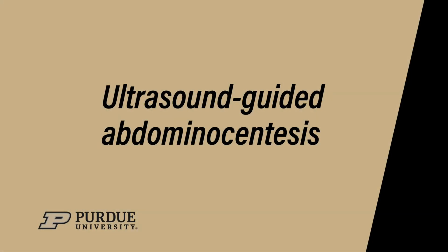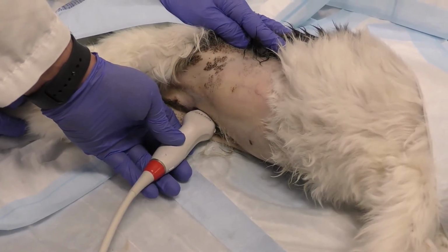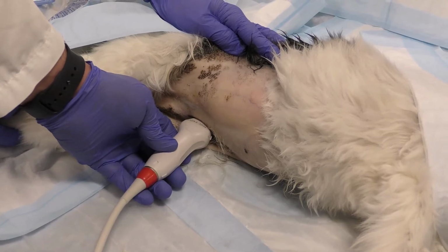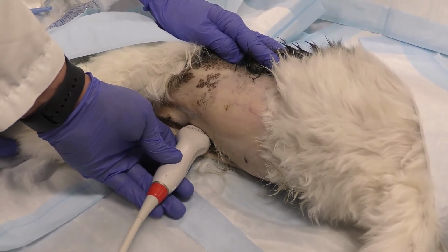Ultrasound guidance allows for fluid collection with smaller volumes of effusion, less than 5 ml per kg, and may allow for collection of entrapped fluid. To perform ultrasound-guided abdominocentesis, place the animal in lateral or dorsal recumbency or allow it to stand. After locating fluid in a good window, for example without the need to pass through another structure, clip and clean the site.